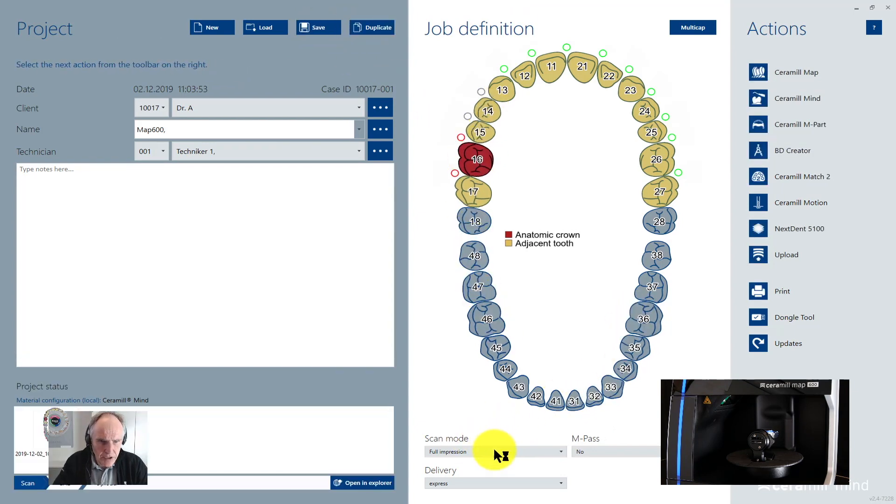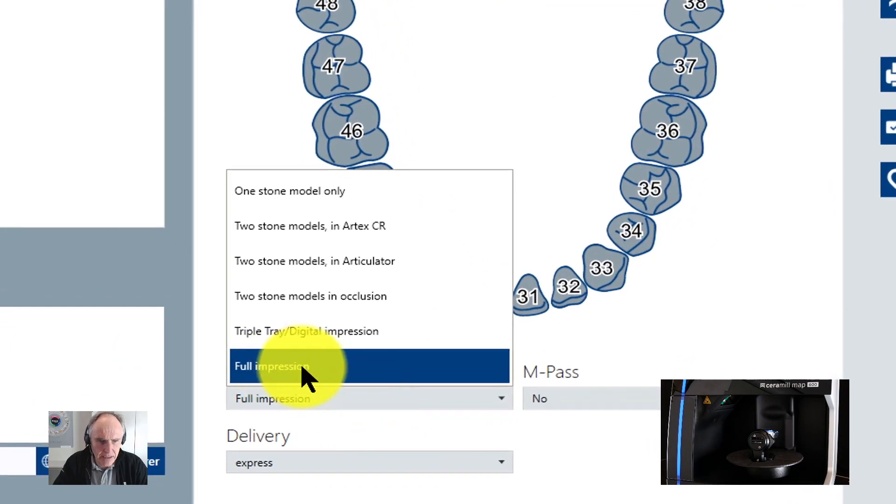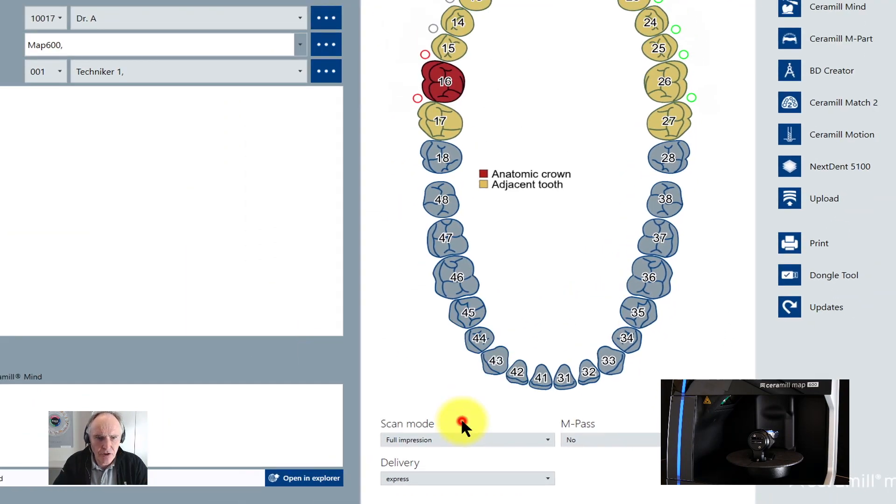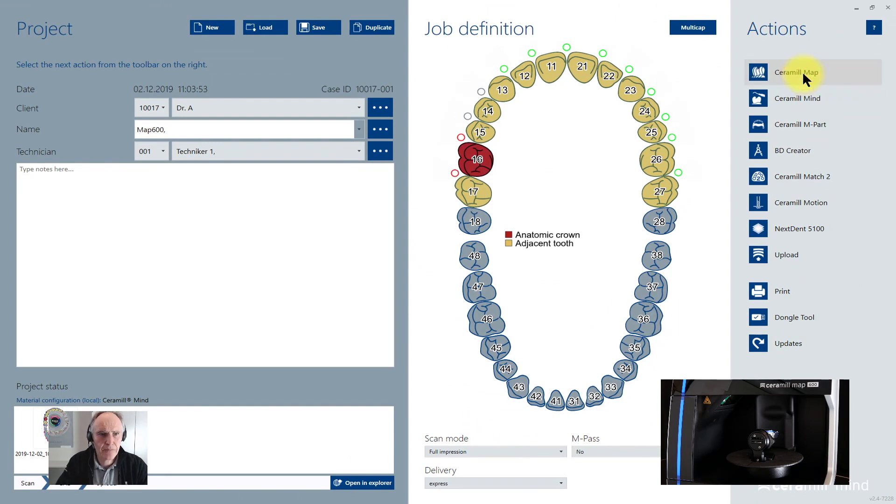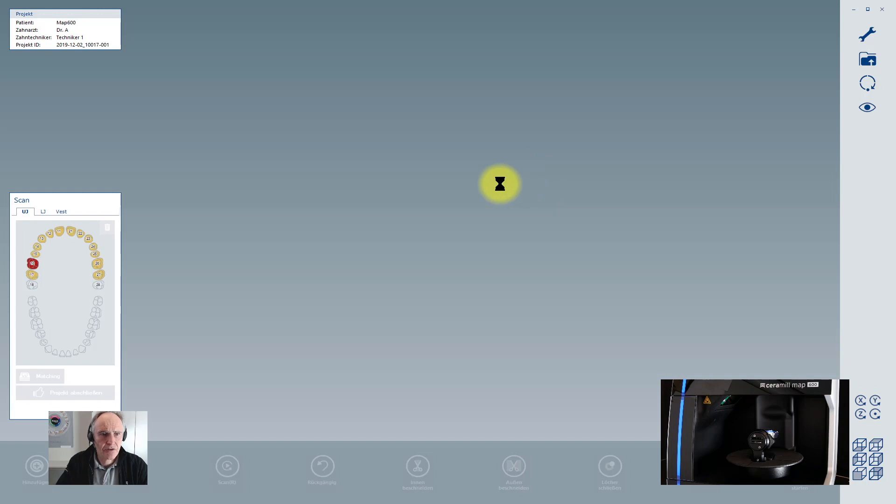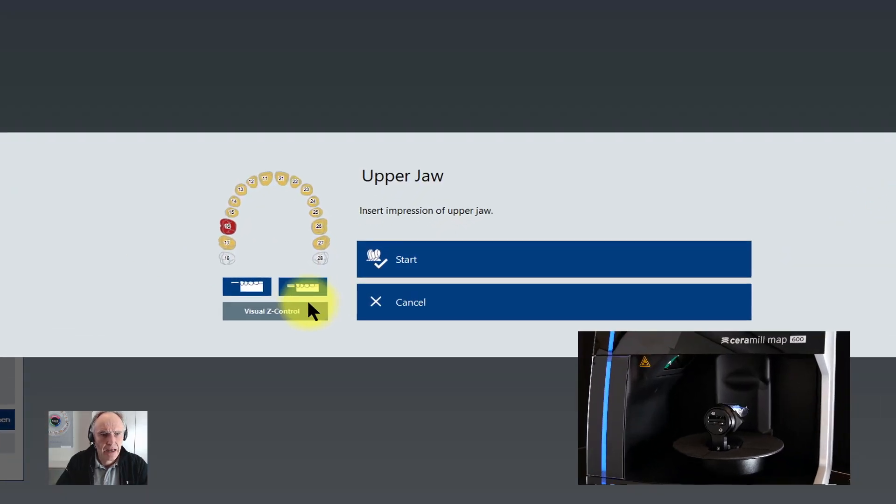Now watch that you have clicked and selected here the full impression, and then we start with our scanning process. You can see that the first scan is now the upper.